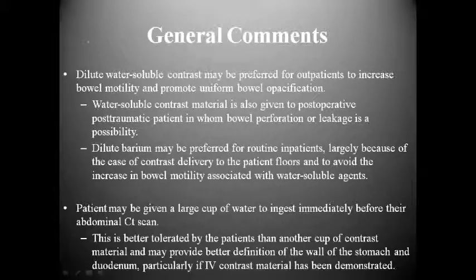Basically, I'm in favor of only using the water-soluble contrast. Even though there is a slightly more elevated cost here than what we would see with the barium contrast, I think that in the grand scheme of things, you actually see better results with water soluble.